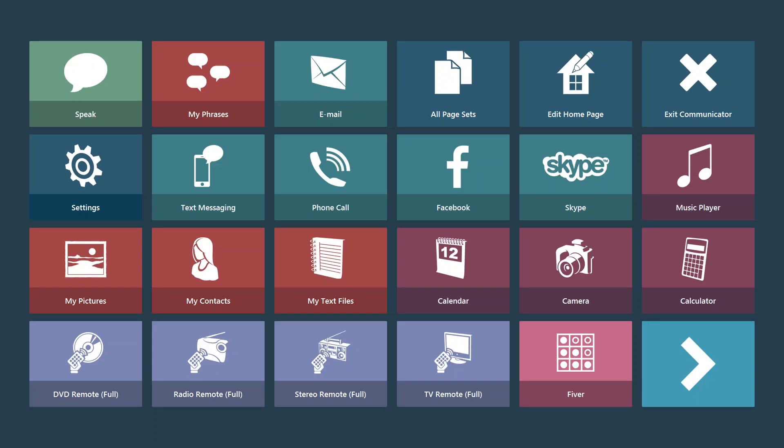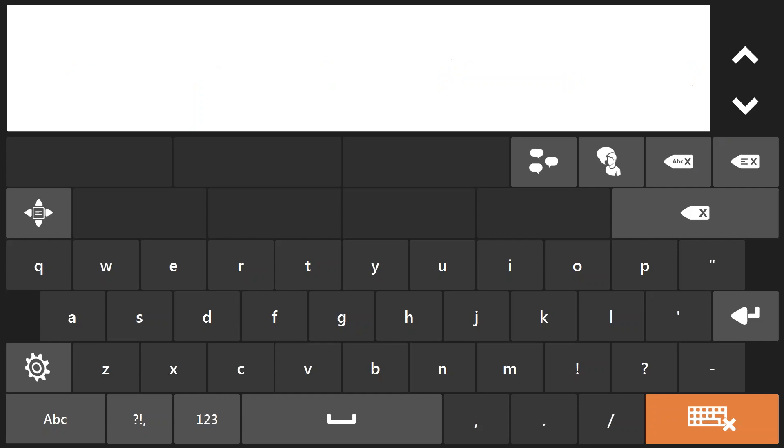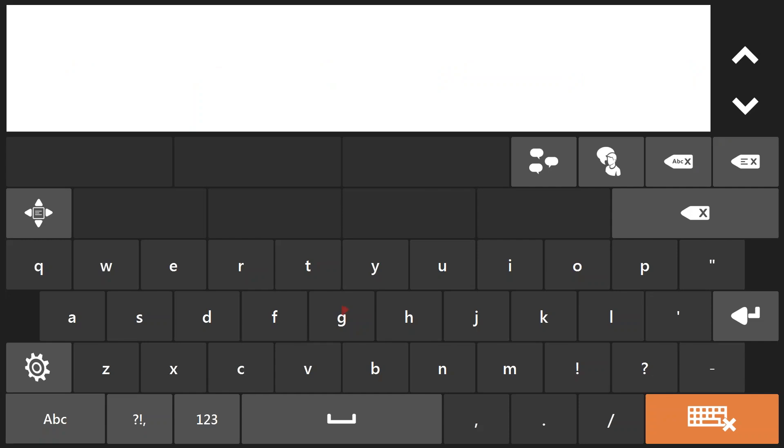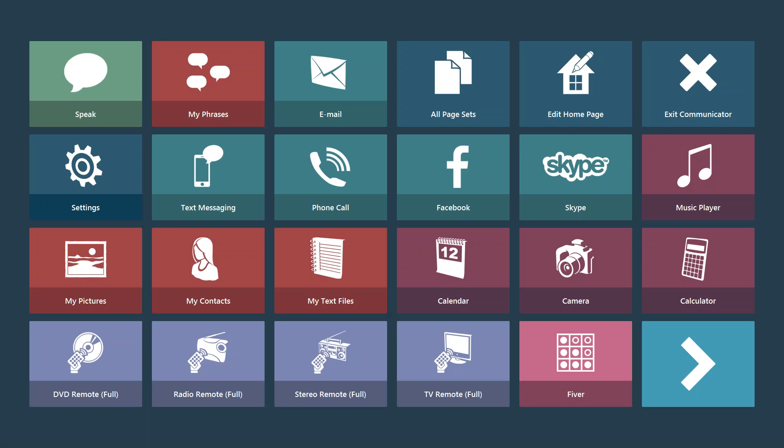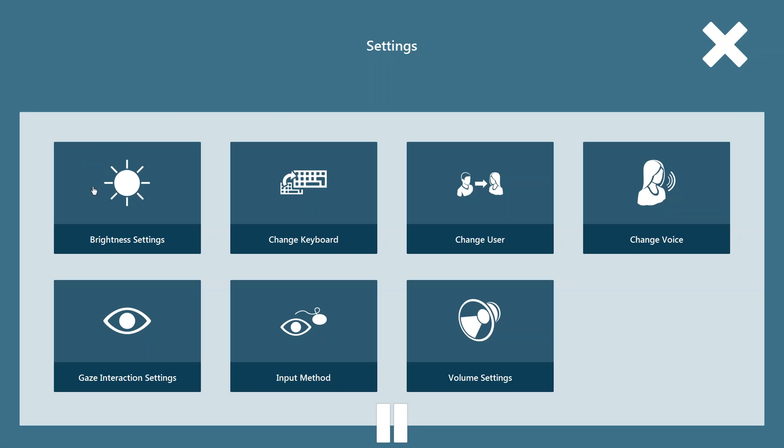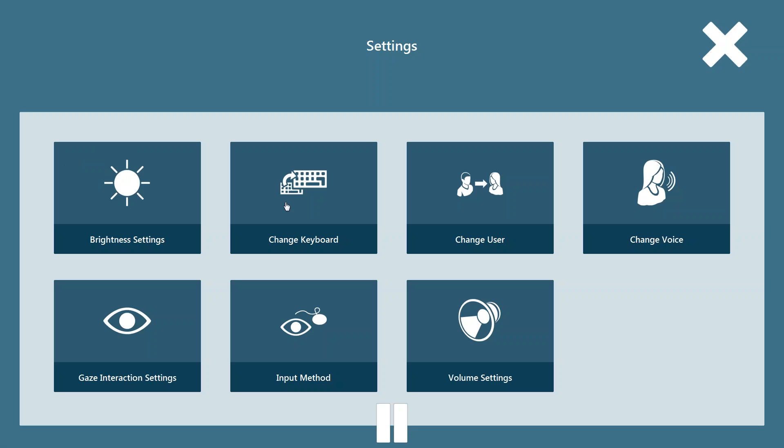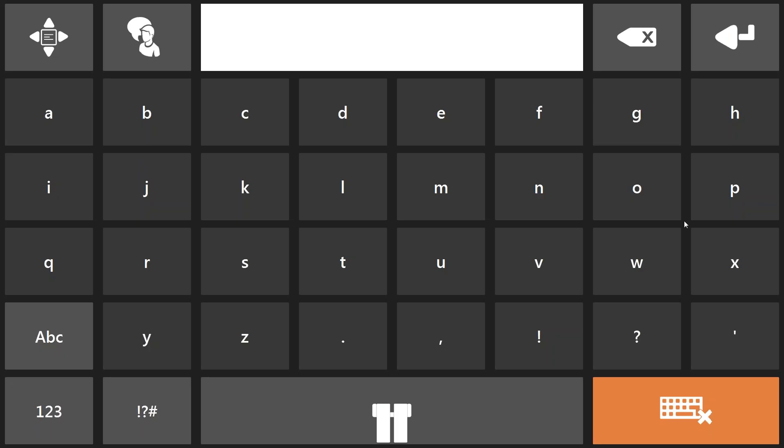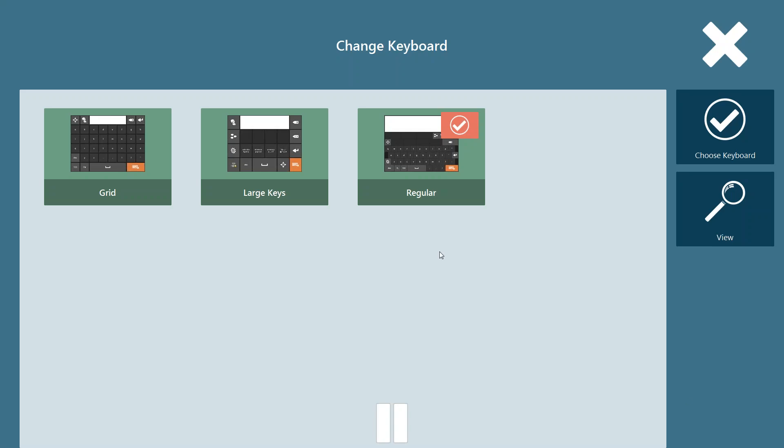So if we were using the keyboard as our primary means of communication and say this was struggling a little bit for me, these buttons were a little small or I was looking at the G but I was trying to get to the H or it kept bouncing back and forth on me, if that was frustrating and we have a good calibration and we're pretty happy with how that looks, then maybe it's time to introduce a slightly larger keyboard until we get used to how the software works and we can practice with one keyboard and then switch back to another. There's a couple ways of doing this. You can go into settings and go to change keyboard and you can take a look at the grid keyboard which is a larger ABC style keyboard.